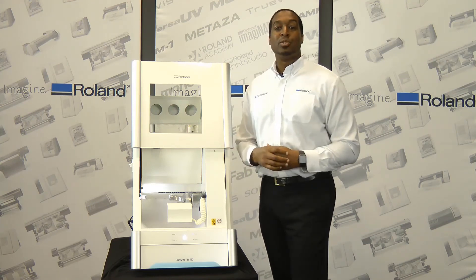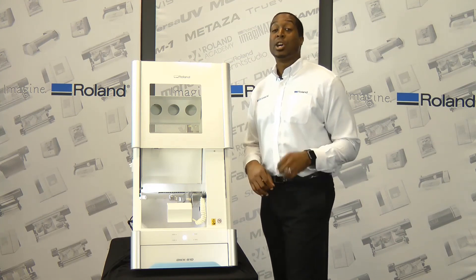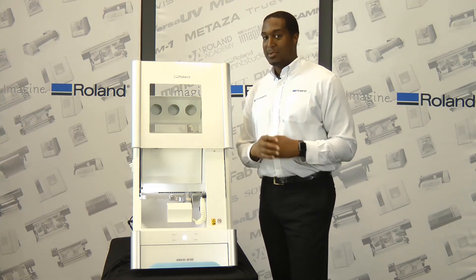This mill is equipped with an automatic tool changer, which gives you the ability to load up to 10 carbide, hybrid, or diamond-based burrs. You can use a combination of all of those, depending on your setup.